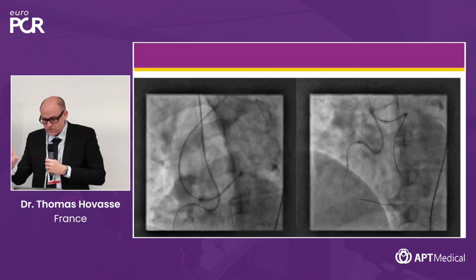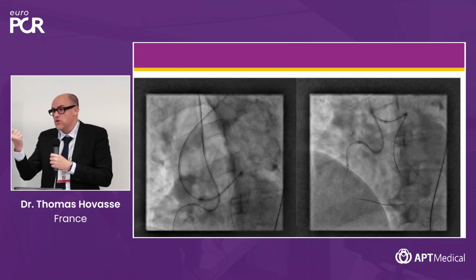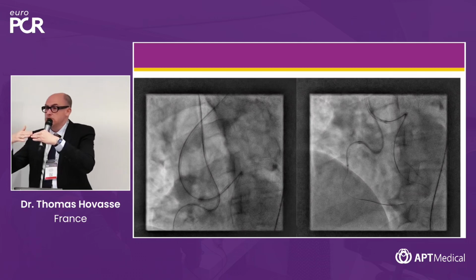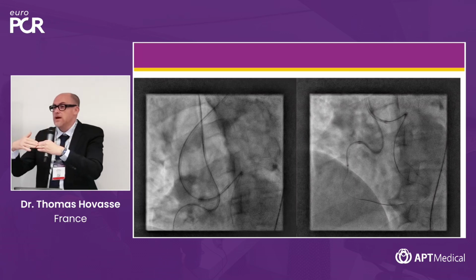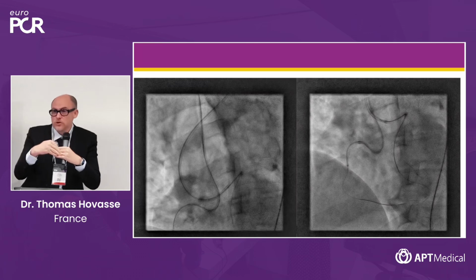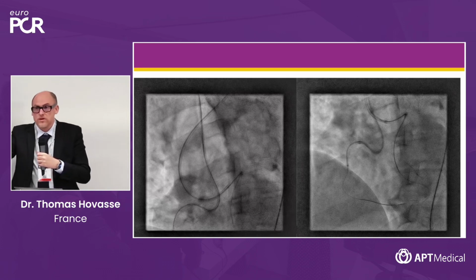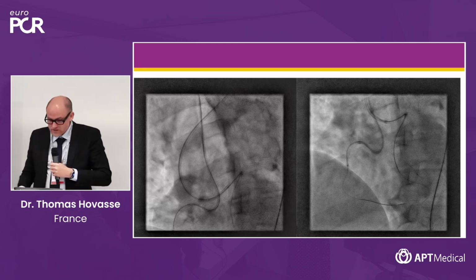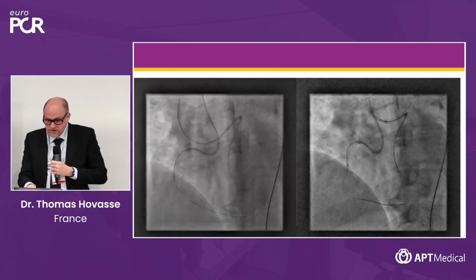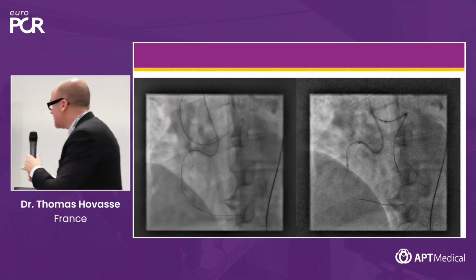And the principle: you inflate your balloon, you take generally a stiffer wire, you bring the Expressman microcatheter near the balloon or on the balloon, and you inflate your big balloon, try to puncture it with the retro wire, and then deflate and advance the wire inside the Expressman. Okay, so that was done here.